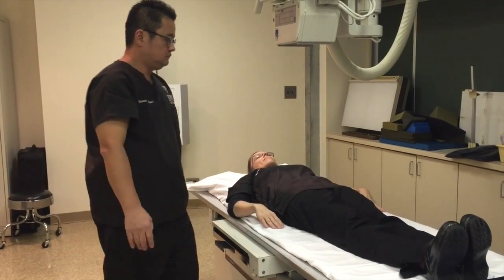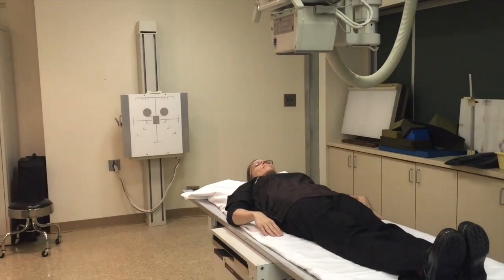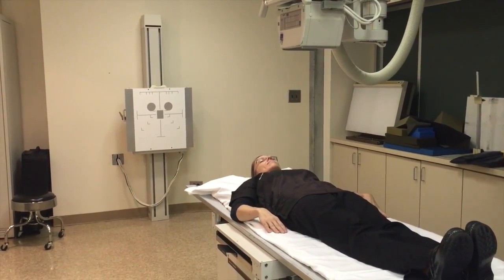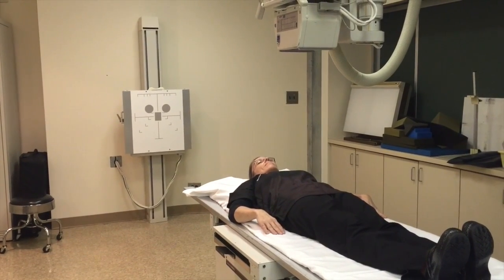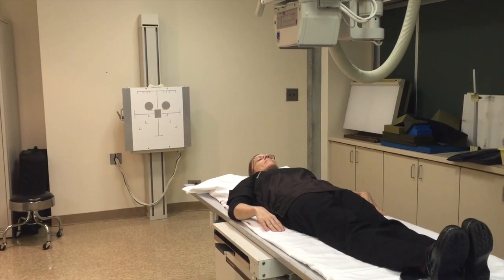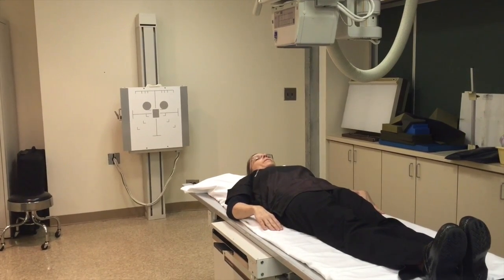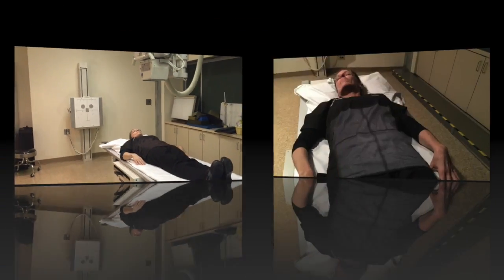The technologist will set technical factors at 80 kVp and 25 mAs. The technologist will then give breathing instructions: deep breath in, blow it out, and hold it out. Breathe.